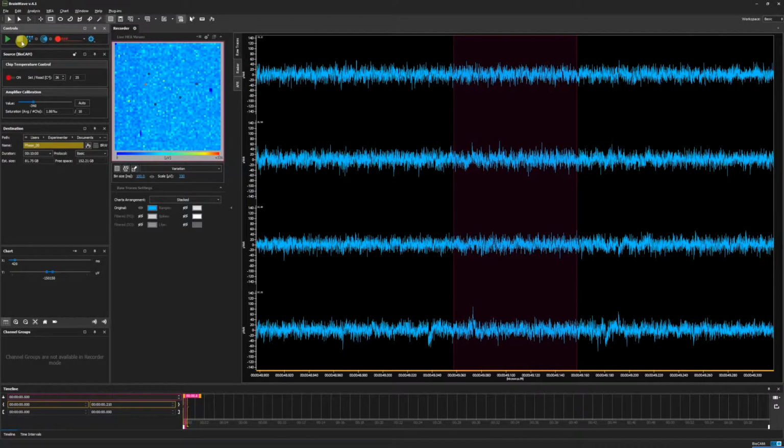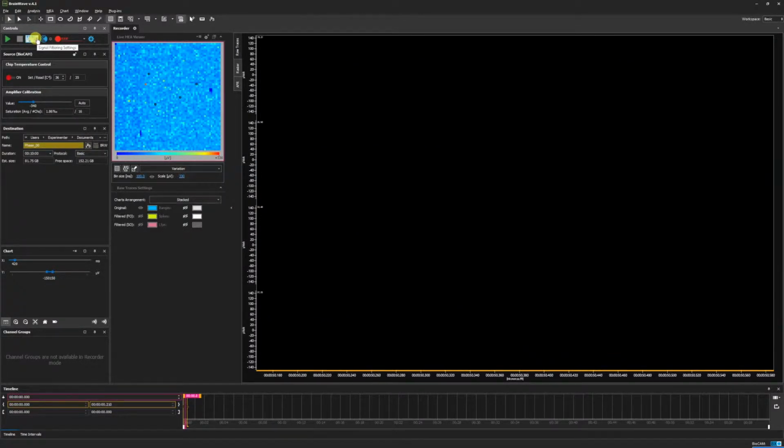As we've discussed in the offline data filtering video, we can enable or disable the filter settings by going to this icon here and clicking it to enable the filtering. Then, by clicking the gears, we can modify the settings. Here we see that the slow oscillation and fast oscillation filters have both been enabled. Clicking the icon here will disable the fast oscillation filter settings, and we will begin focusing on the slow oscillations.